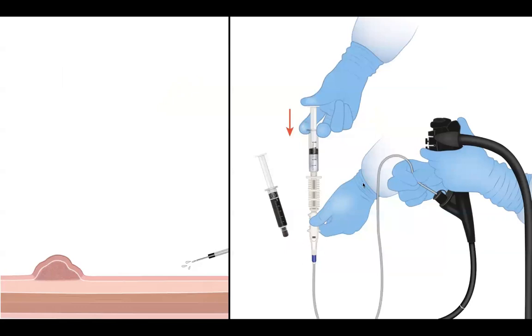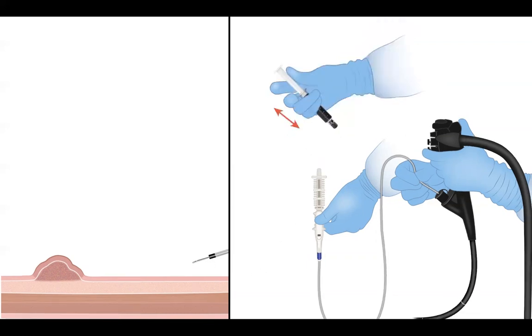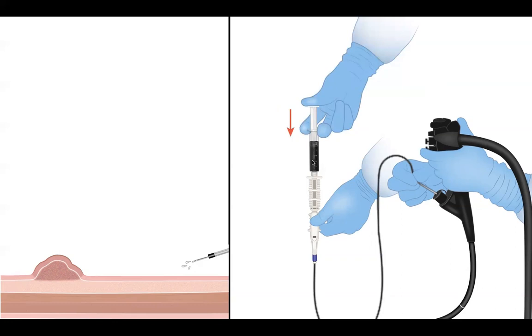So this is what I do. I have a needle and I've used the saline. I tell my assistant to purge the needle with saline. Once I purge and flush the needle, I take the carbon spot here, and I ask them to inject until it comes to the biopsy port. That's where I ask them to stop.